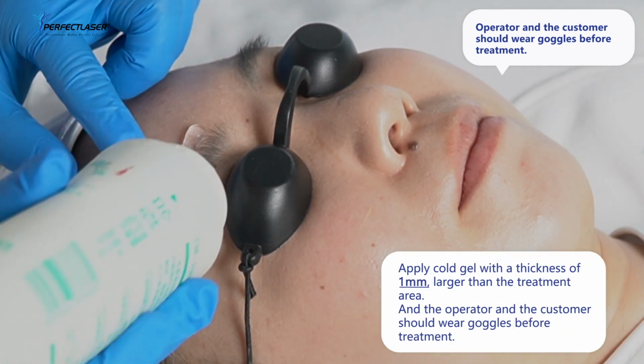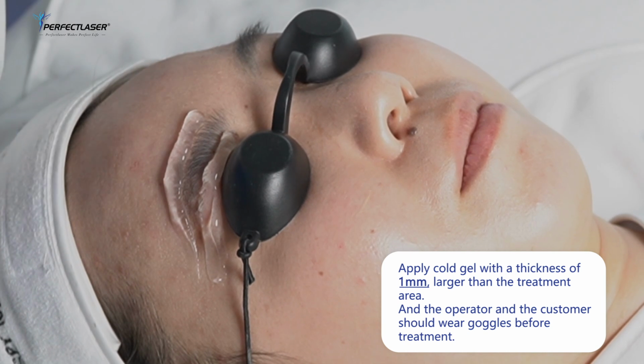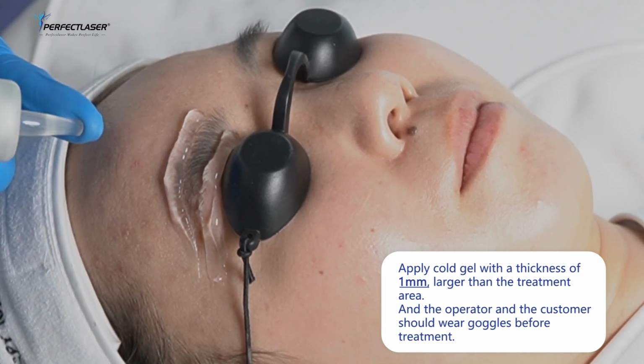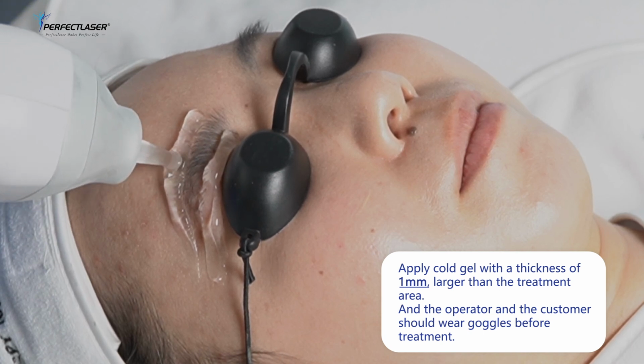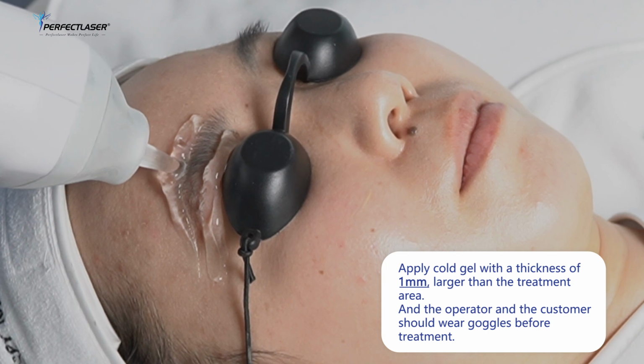Apply cold gel with a thickness of 1 millimeter, larger than the treatment area. Prepare for the operation. Press the handle button to make the handle fit the skin for fixed point operation. The customer will feel warmth at the treatment part. If not, you can increase the energy or pulse width. Use the cooling on the handle to calm down the customer's skin, which will be more comfortable.